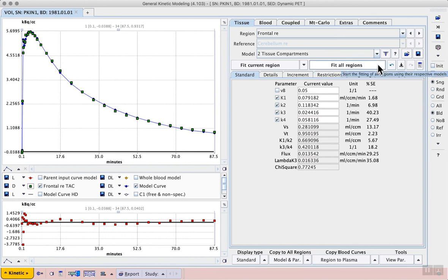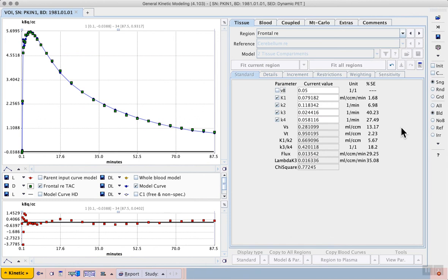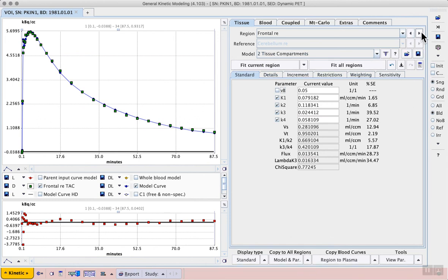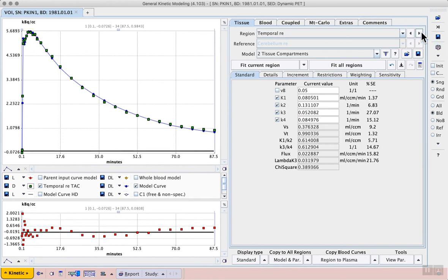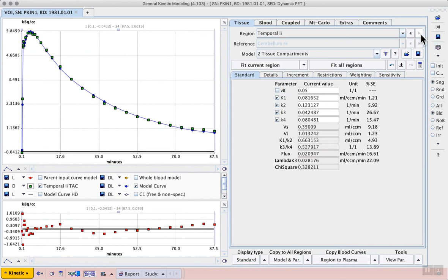Then we can go back up to the top of the tissue tab and select fit all regions. Then you can step through the available regions using the shortcuts in the top right, seeing how the model fit is appropriate for each one.